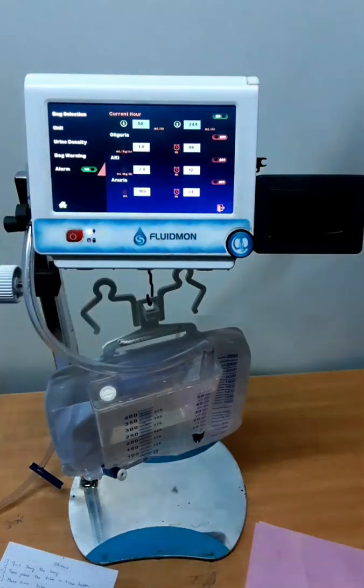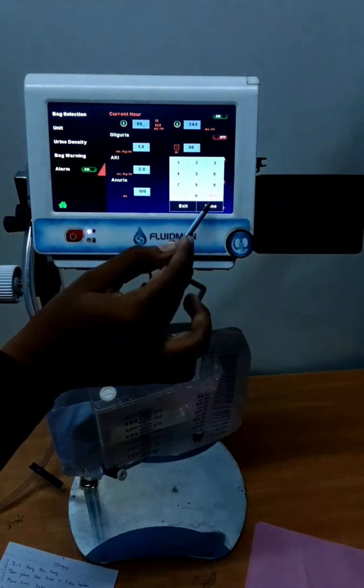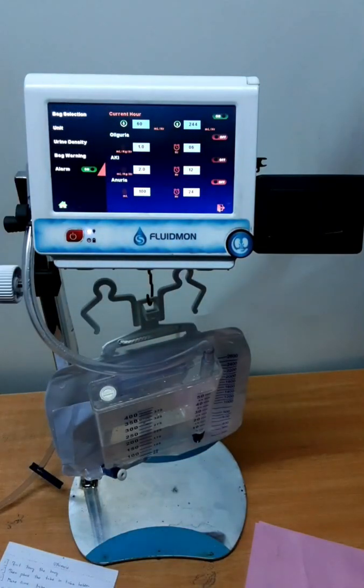Now change the limit. First turn on the alarm, then change the limit. For example, I am setting it to 60. Depending on these limits, the alarm will be generated. This is the advantage of our machine — to indicate illness of the kidney.